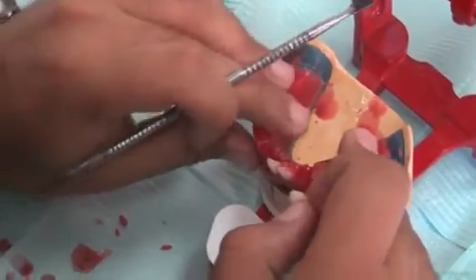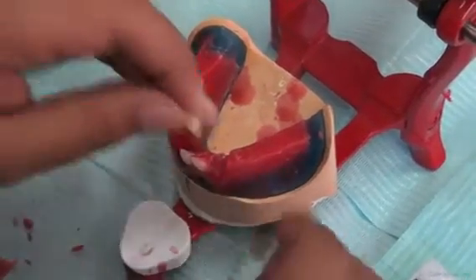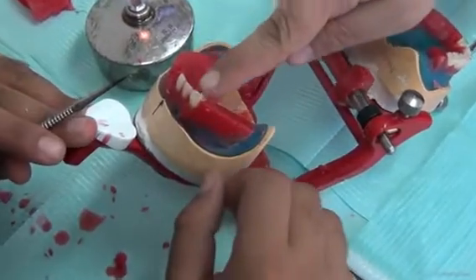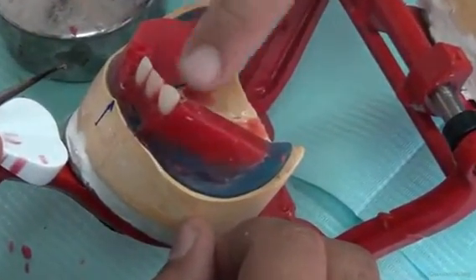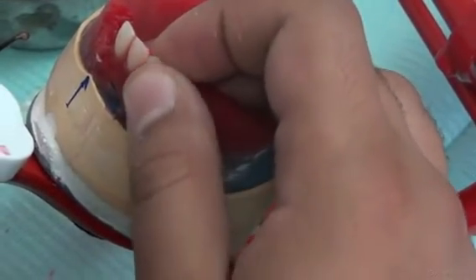So we're trying to melt the canine position. Make sure that we have enough window for the canine to be added with a distal inclination. So we're concentrating first on putting the canine edge with the incisor edges and in the correct distal inclination, and then we slightly rotate it to the inside because we want it also to follow the arch here. Okay, so if I place it like this, after I make sure that the incisor edges are together, I rotate it inwards to make sure that it's within the arch that we're working with.